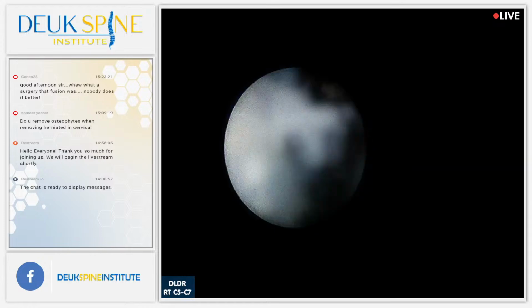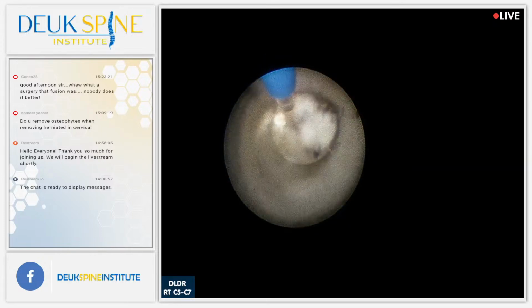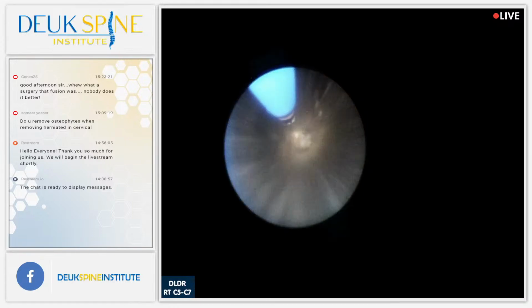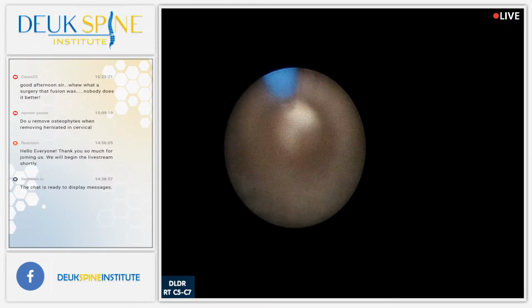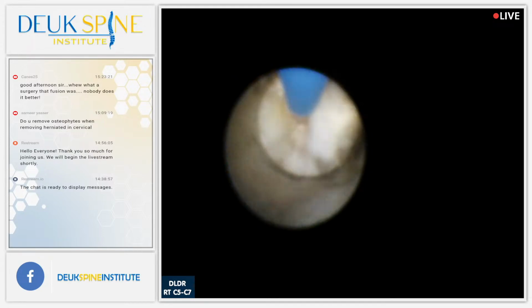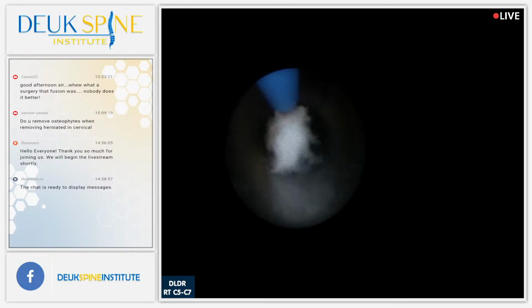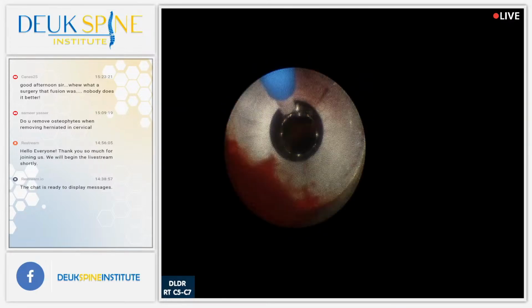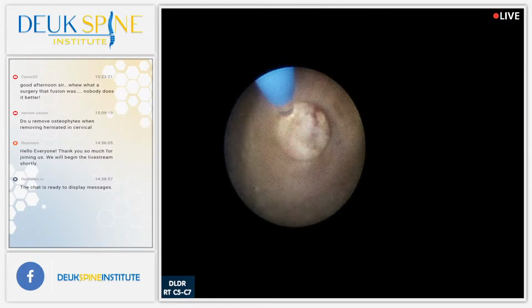Get these pieces out. So I see a lot of calcium, but I also see a lot of, I could give him some more. I don't know how much it's going to help. That lasts 50 minutes. Yeah, these are just pieces of herniation coming out.